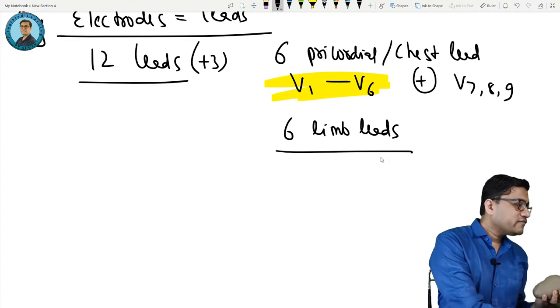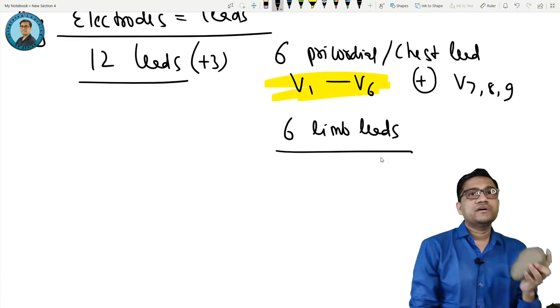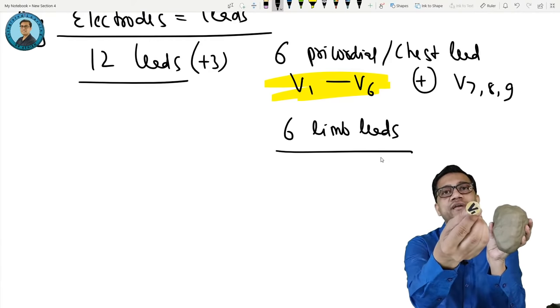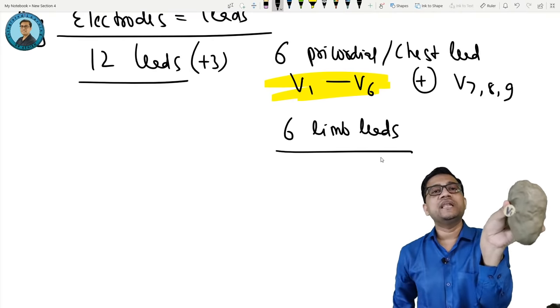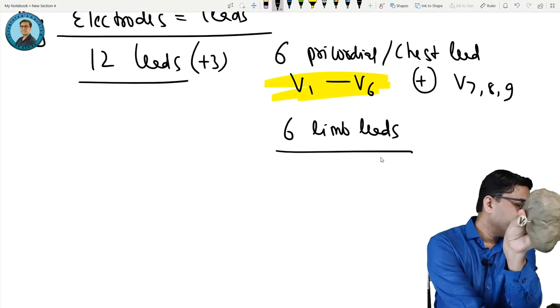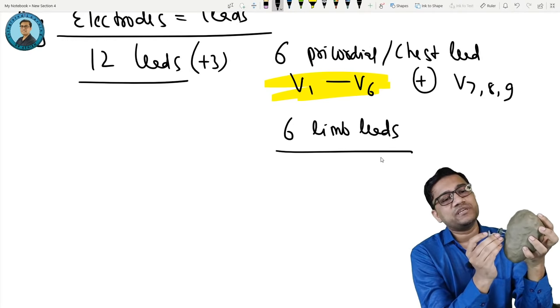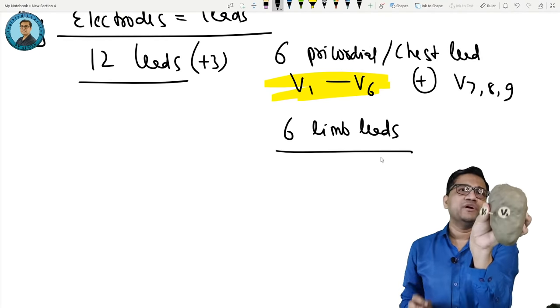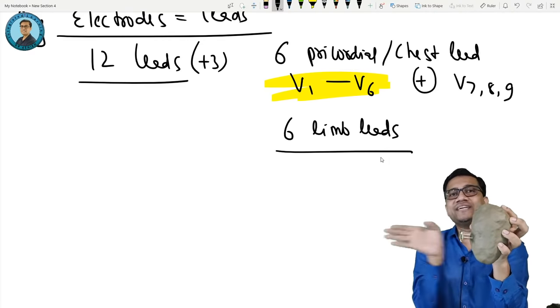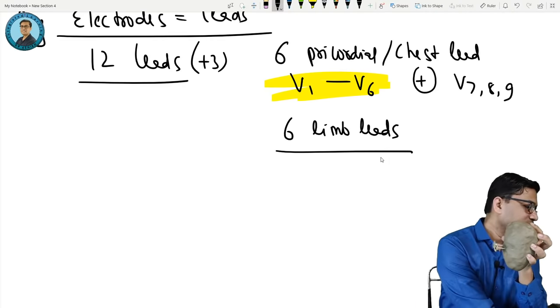So what we start with is the precordial. V1 is put on the right side like this. Can you see? So this is lead V1. Then we will put V2 just next, at the exact location. We don't have to learn, like fourth intercostal, second; I just skip that. So these two are seeing where? The side, that is septal. So they are seeing the septal.